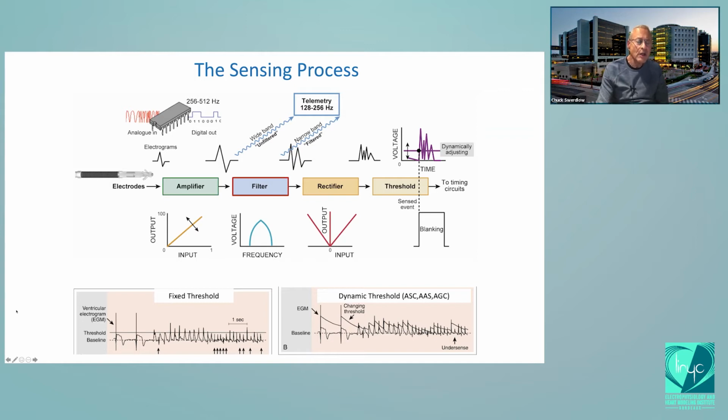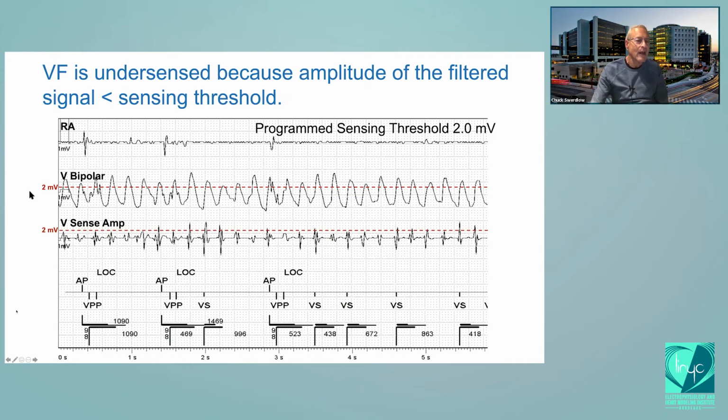The filter changes what the electrogram looks like. It is true that this is the signal coming off the sensing channel. I didn't trick you in that regard. But the signal coming into the device is not the signal compared with the threshold. That is the signal after filtering. I picked an electrogram from a company, one of the few, maybe the only company, that gives us both the unfiltered and filtered signals to see the difference.